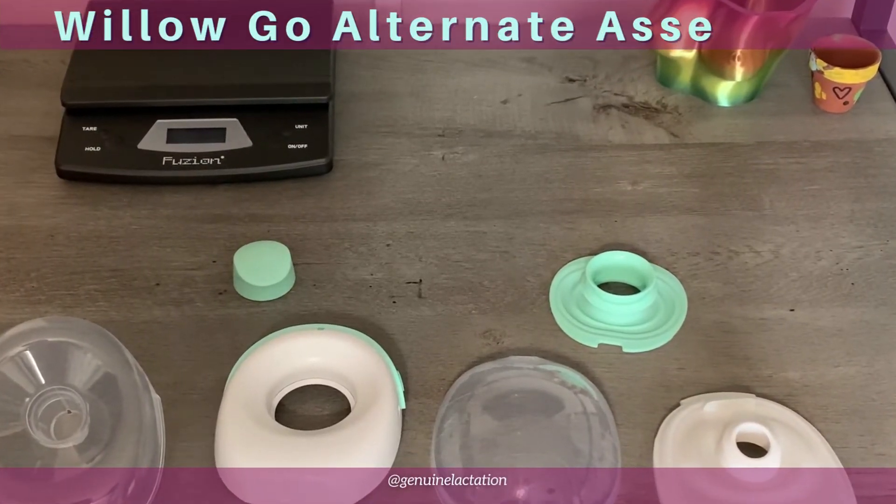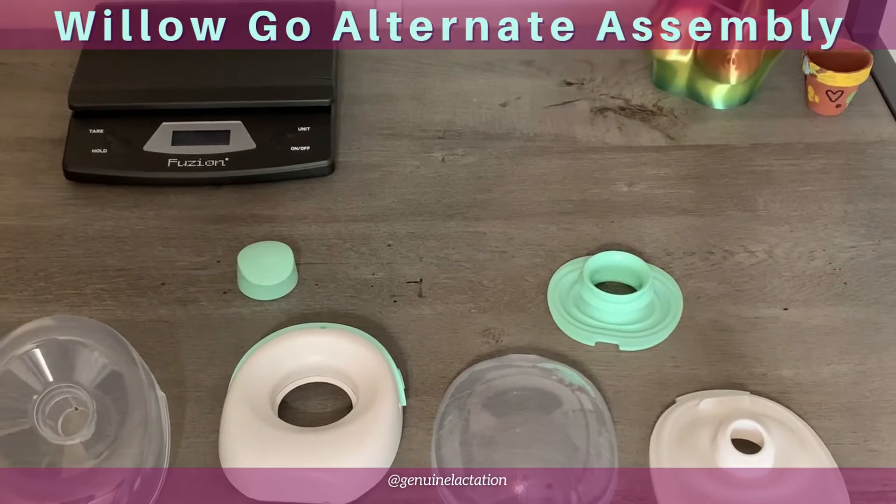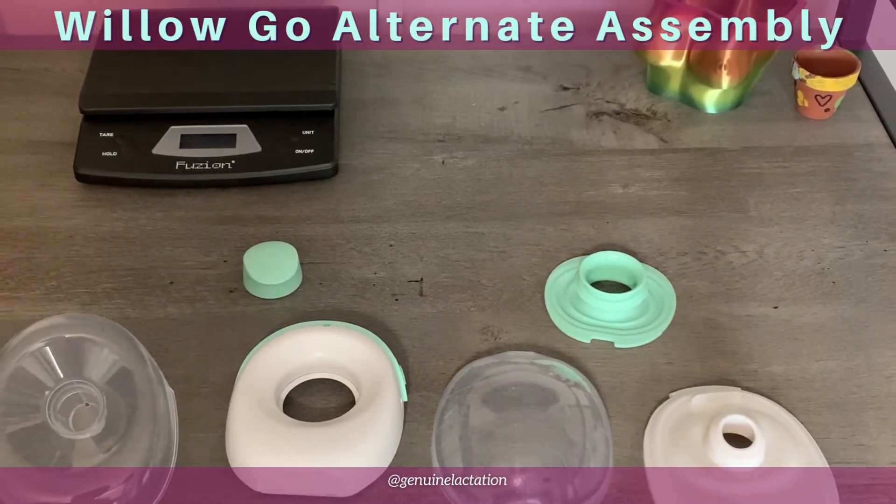I'm going to show you an alternate way to assemble your Willow Go, and it may help you find some of the assembly errors that are causing your problem.